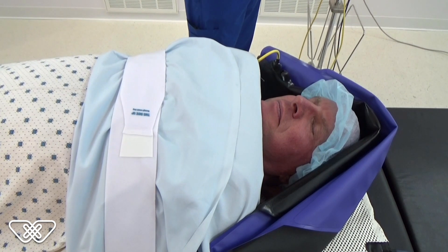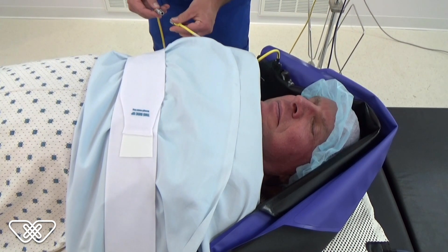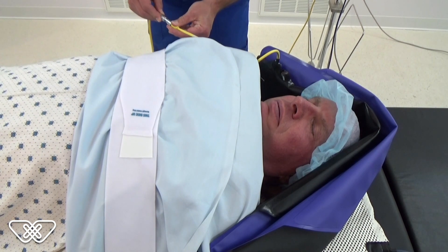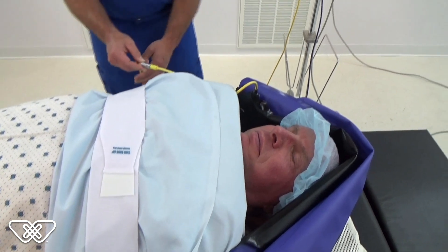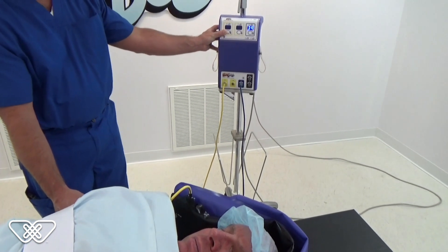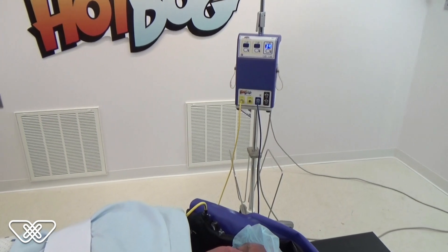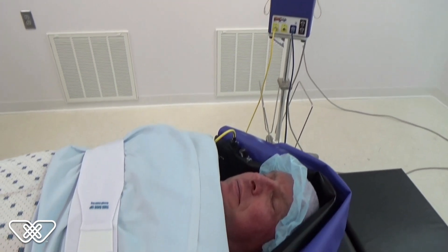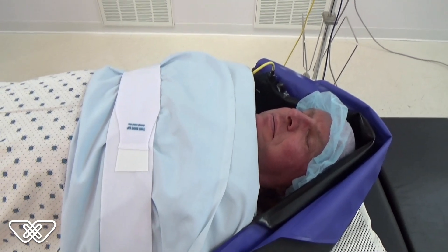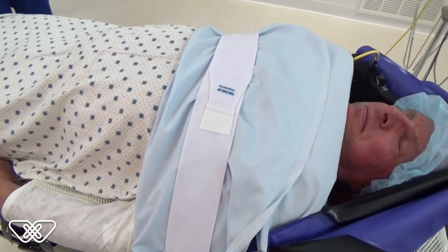Connect the blanket's yellow cable to the yellow cable from the controller by pushing them together. Set the temperature at the controller to the maximum setting of 43 degrees Celsius. Hot Dog provides conductive, radiant, and infrared heat transfer above and below the patient for better warming outcomes. The warm surface is a huge patient satisfier and provides a head start on combating intraoperative hypothermia.